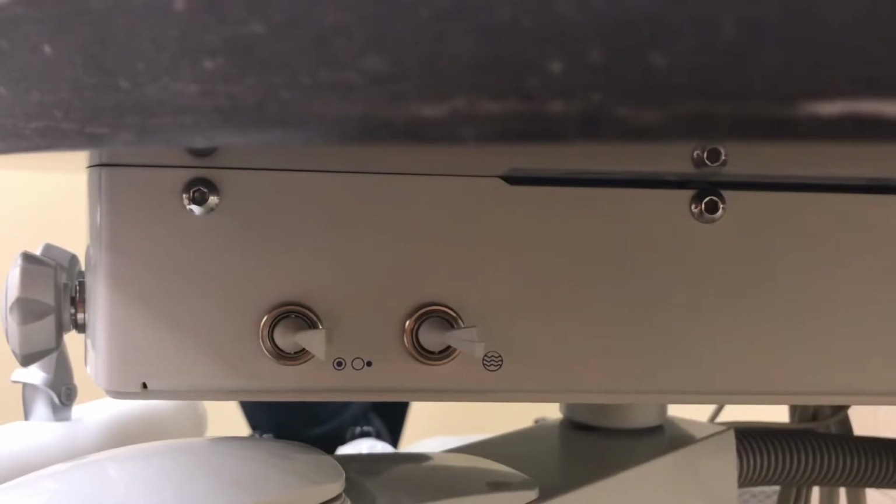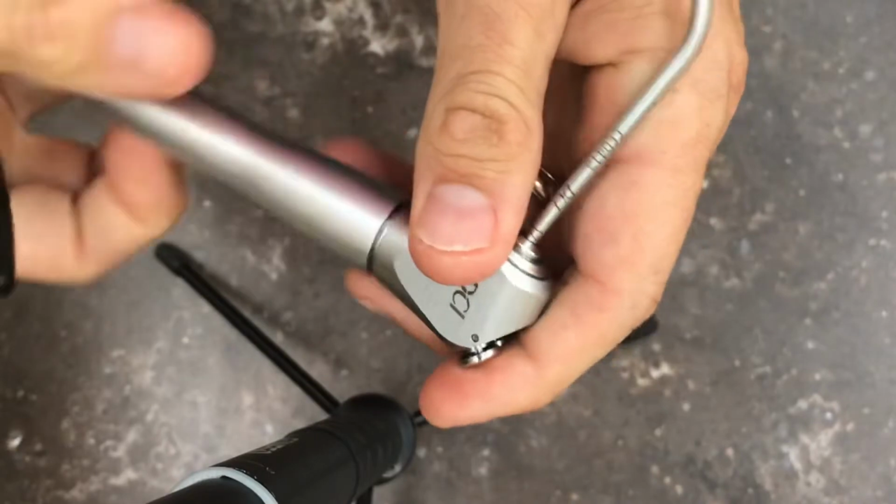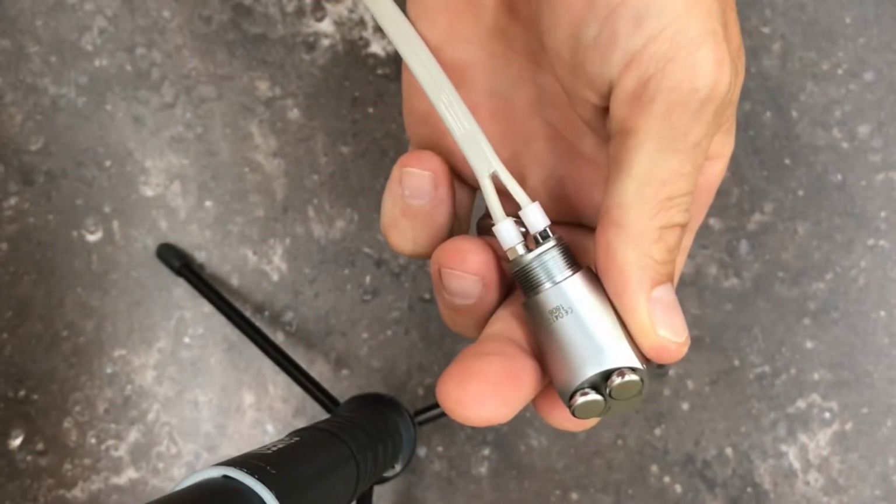Go ahead and make sure that the master switch on your unit is turned off. Next, go ahead and unscrew the air-water syringe handle and mark the water side of the tubing with the Sharpie.